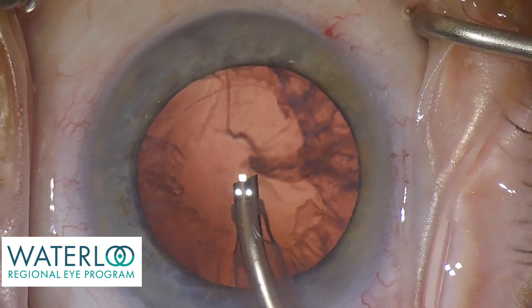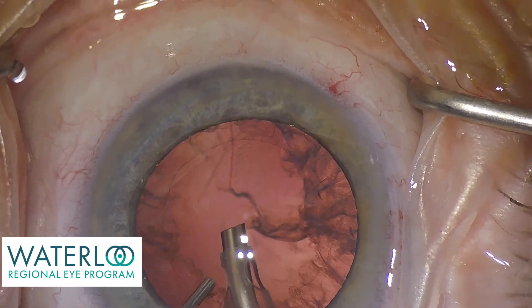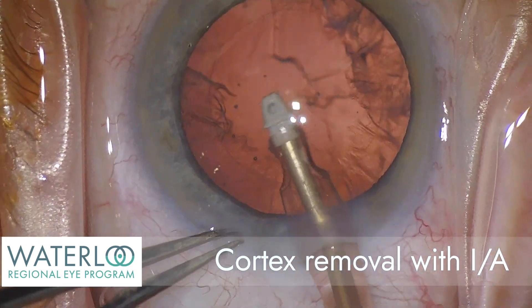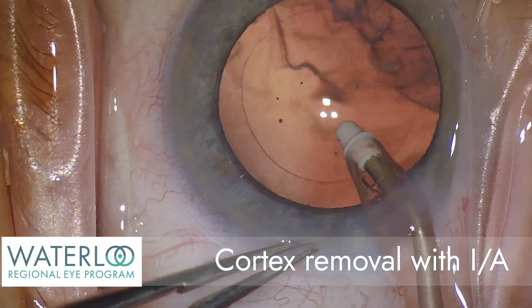But the outer coat, the cortex, still remains. The cortex is aspirated with a smaller handpiece that uses specialized irrigation fluid.